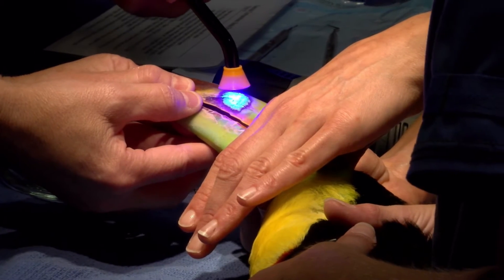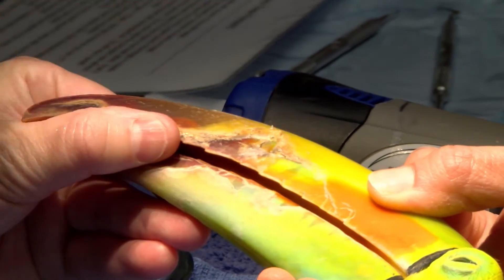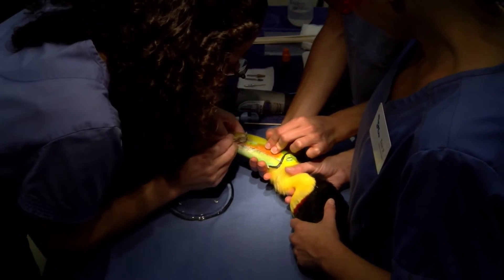I want to be sure that it all cures. That really does fill in all those layered gaps of a toucan. Who would imagine dental acrylic working on our toucan bill here? This may be all that he needs — just two layers.